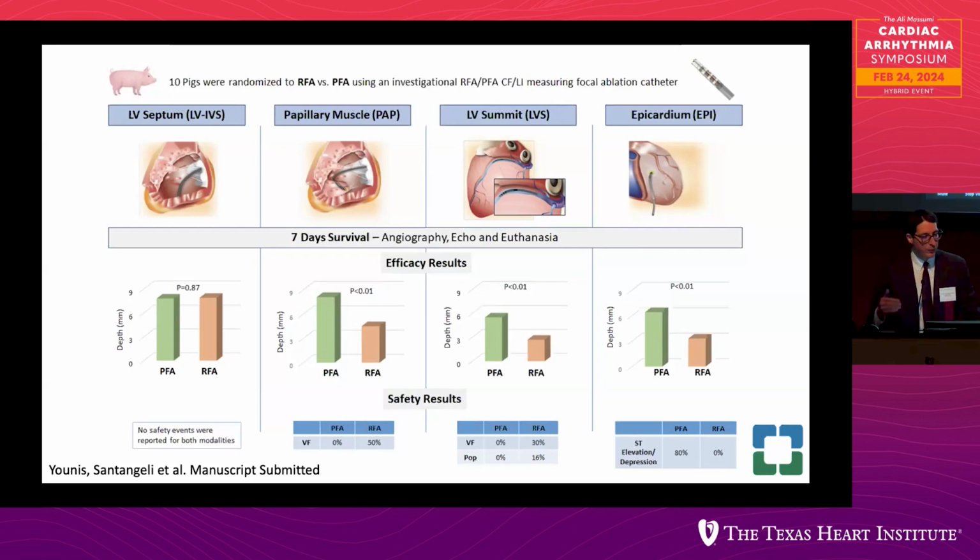We showed the coronary angiogram. We didn't find any significant coronary narrowing or spasm, and histology also didn't find any evidence of that. And the other aspect of it is that we were looking at intracardiac echo. In those cases, we didn't find any evidence of wall motion abnormality. So again, this suggests that it has nothing to do, or maybe not much to do, with the coronary arteries.